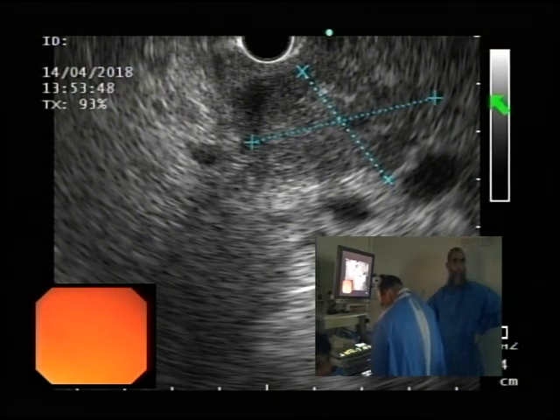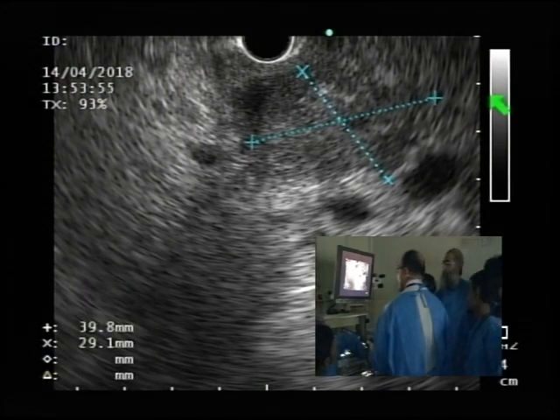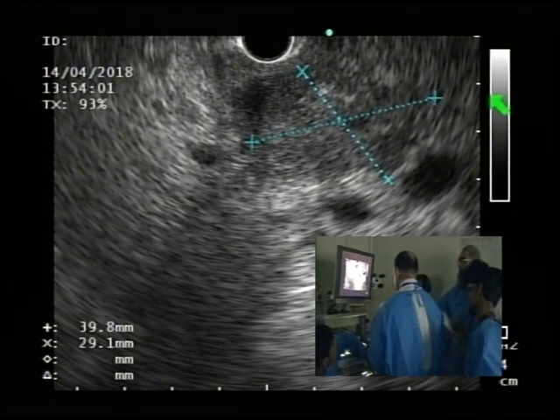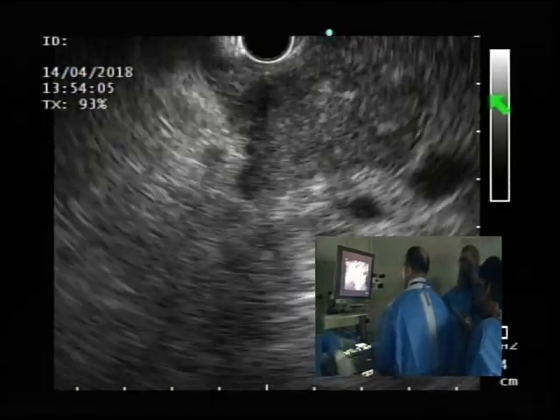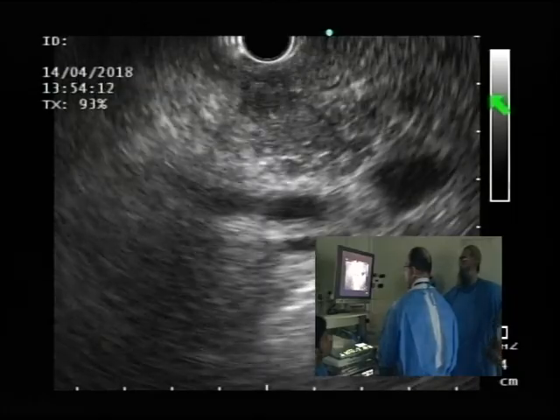Is the resident there? Do we need to sample that? It's a pancreatic mass involving the ampulla. In measurements, you can write 4 by 2.9 centimeters. Okay? Yes, so we can sample it. And by the way, these are the mesenteric vessels below it, the SMV and SMA.